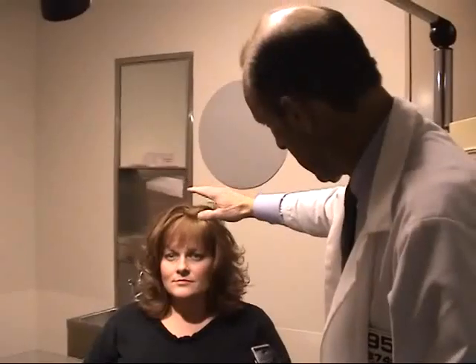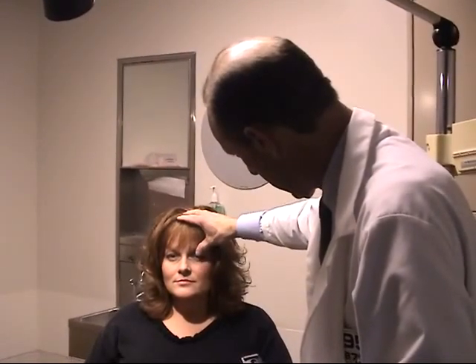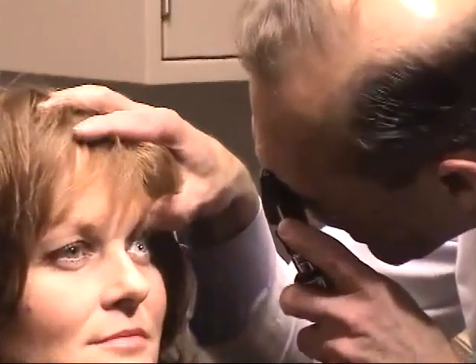Now place your free hand on the patient's scalp and lift the upper lid slightly with your thumb. Approach the eye at a 15 degree angle, drawing as close to it as you can. Use your free hand as a guide, stopping when your instrument bumps against the knuckle of your thumb.